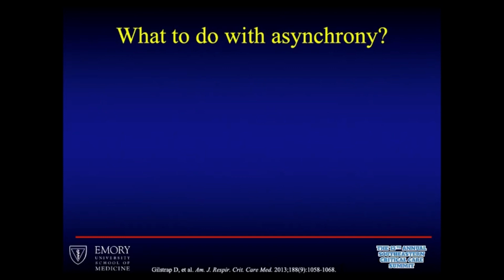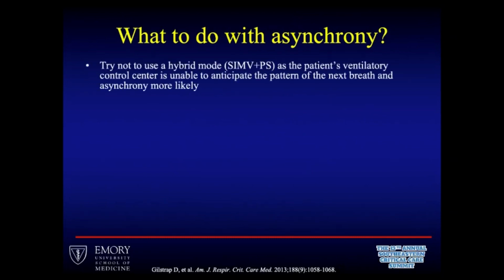All right, so what to do with this asynchrony? So my last slide says good luck, because that's essentially how I feel. So the first thing is try not to use a hybrid mode. If the patient is on pressure support with SIMV, and the breath pattern is changing with every breath, the breathing center in the brain has a very hard time keeping up with what's going on, anticipating the pattern, and synchronizing to it.